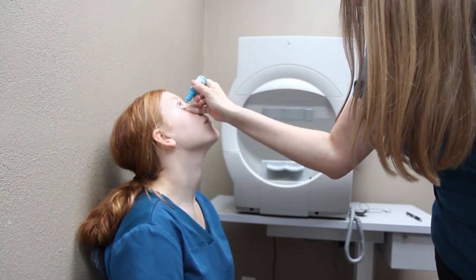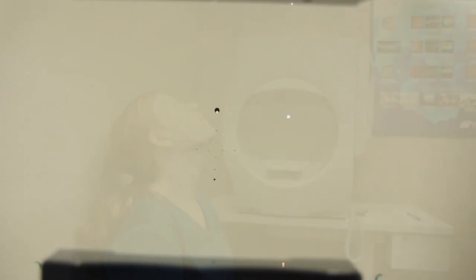You can ask for another eye drop if your eyes feel dry. It's okay to make a few mistakes because the computer will retest any lights that it thinks you may have missed by accident. However, remember to try to be as accurate as possible.